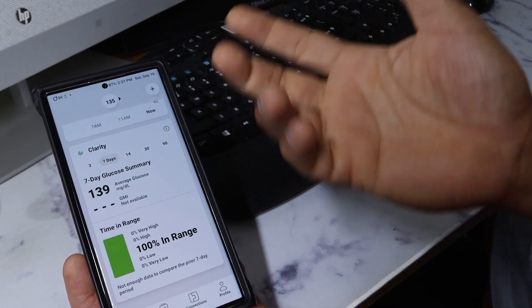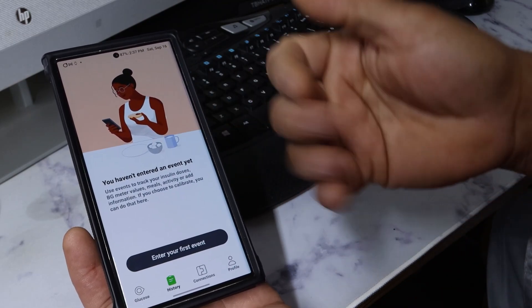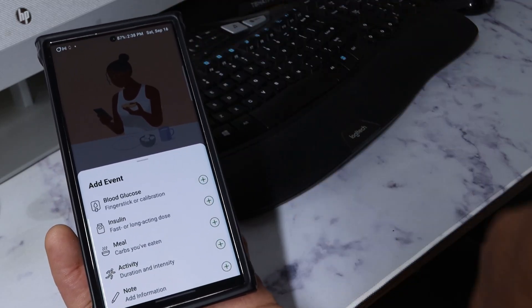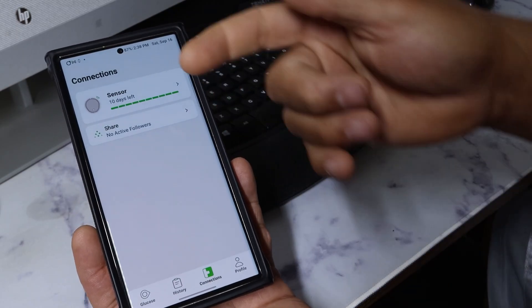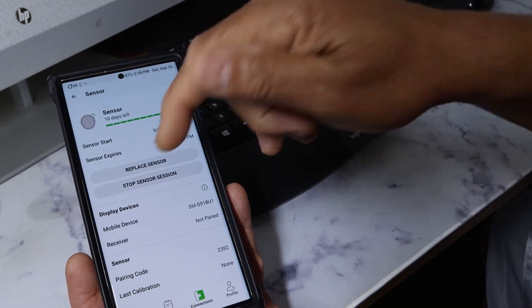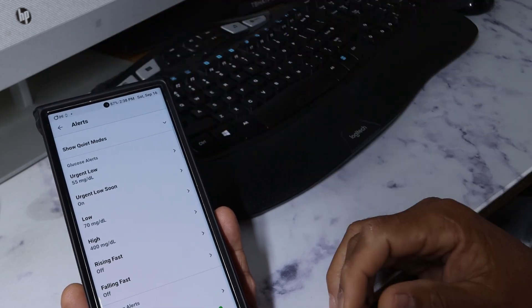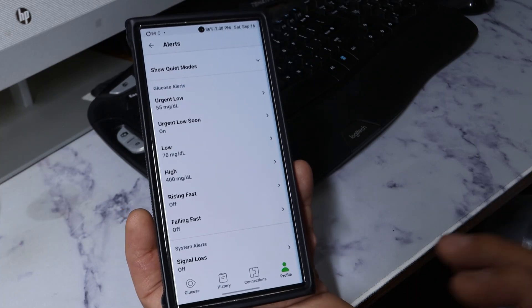It gives you a time-in-range view — so far it's been 100% because it just started at 135. There's a history area where you can input how much insulin you took, what you ate, how many carbs, and activities — because running and walking help with your numbers. You can see connection info, your sensor code, when it started, and when it expires. Then in your profile you can change your alerts — set what sound you want, what high or low glucose threshold triggers the alert, and all that. It's pretty well made overall.